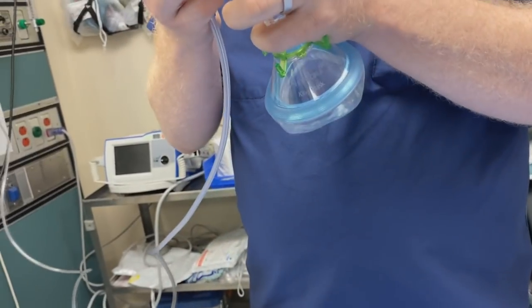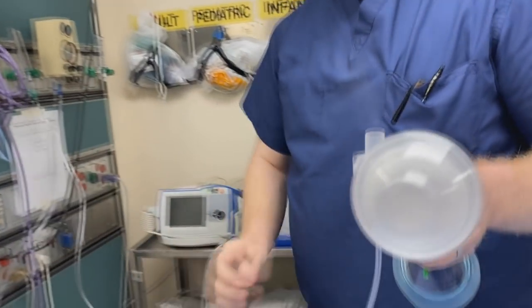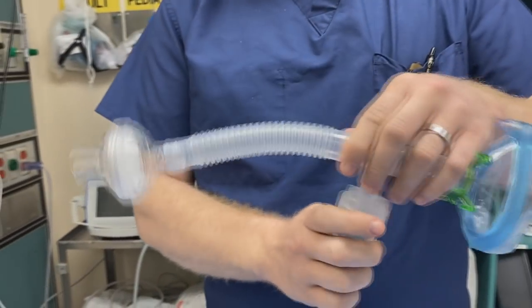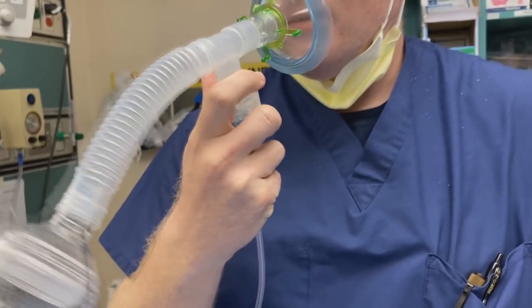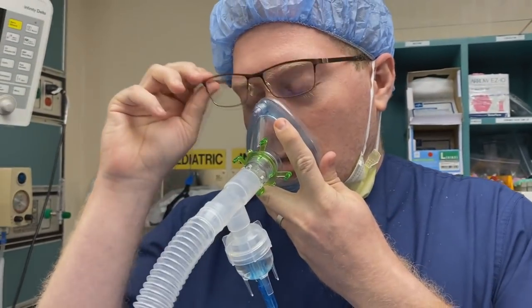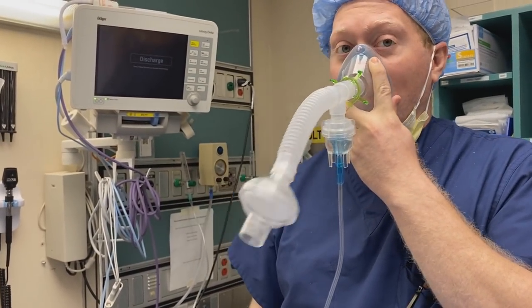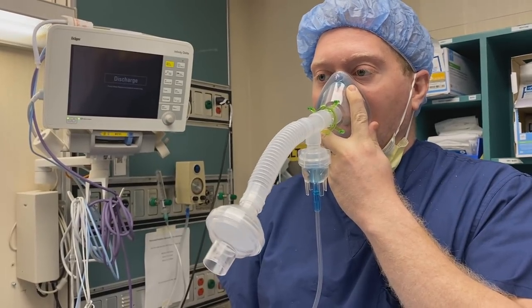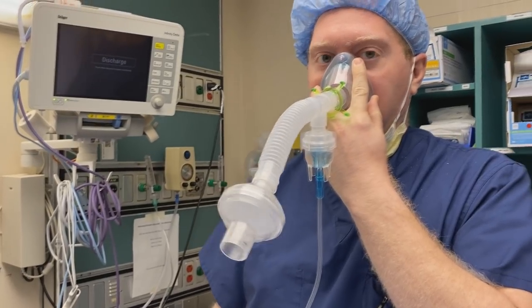There we go — now we're getting some smoke. Now breathe on it; see how it feels to breathe on it. No resistance, no significant resistance. You're breathing easily.